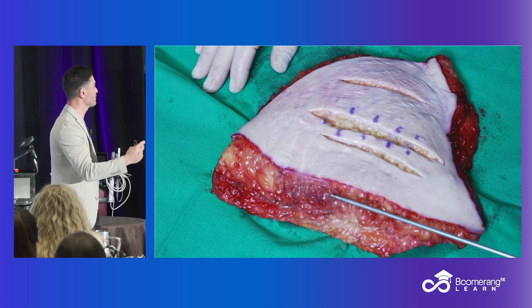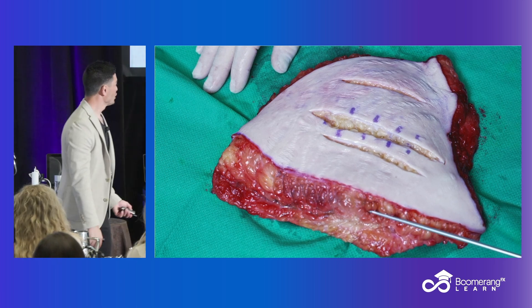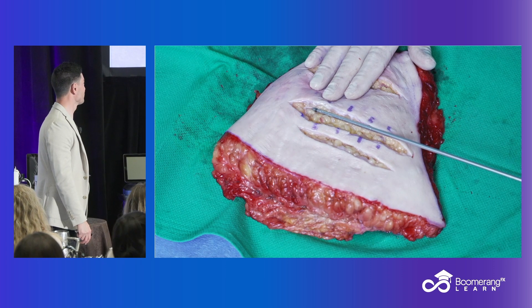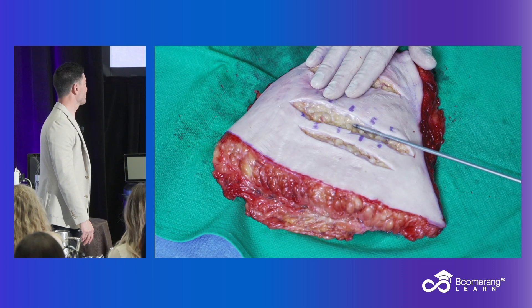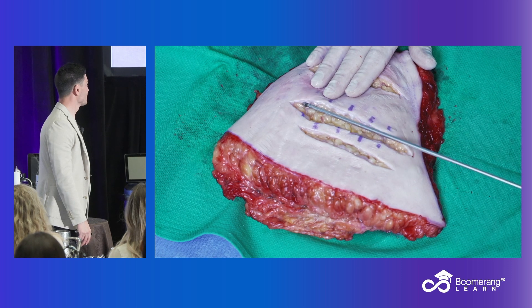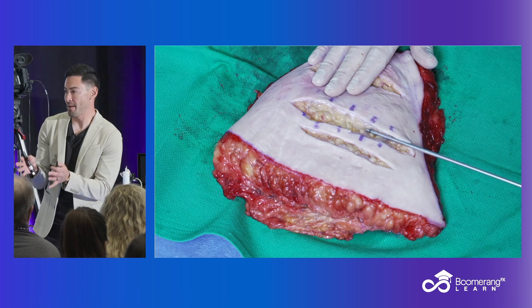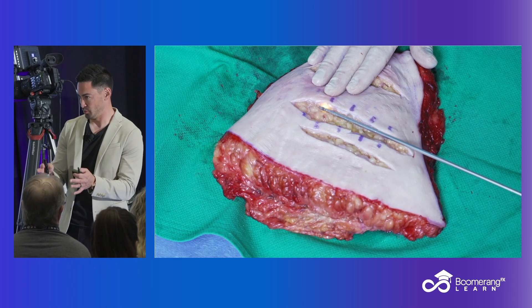It fills that gap between Morpheus Body and BodyTite. No aspiration required, just in the office. I really feel like this is going to be a game changer. It's tolerated very well. And for me, who has the opportunity to do surgery or BodyTite, it's filling a gap — it's filling a gap in my tool set right now.